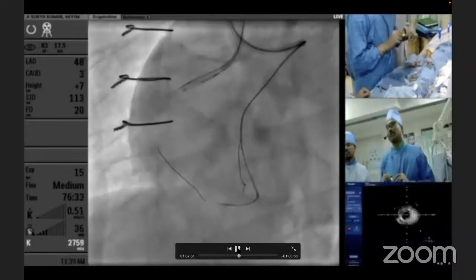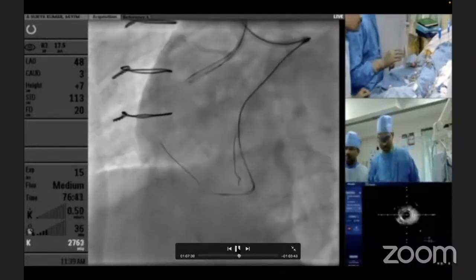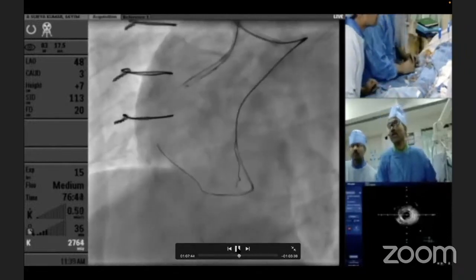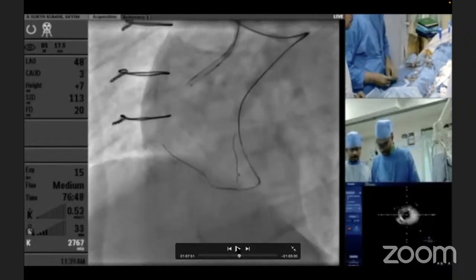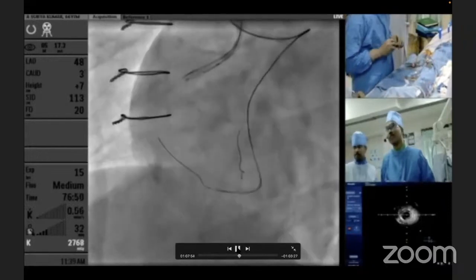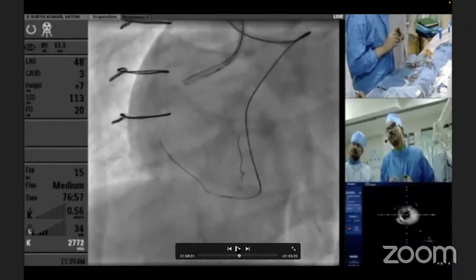Yeah. But Sharath, I'm just asking for everybody's sake. Suppose we've decided upon an investment procedure, and for investment procedure, we know that our antegrade wire will be subintimal. We'll dilate the subintima and hope that it connects with the intima. Now, what is the risk of advancing the microcatheter? Anyway, we are going to balloon that segment of the vessel. We can advance. In fact, I have done it subsequently. And Sharath, so far you have not thought about investment procedure, right? No, till now during the procedure, I never thought of investment.